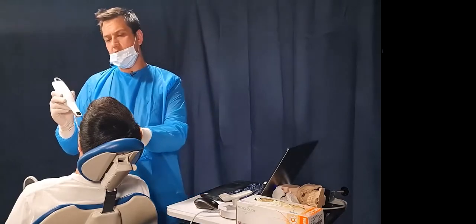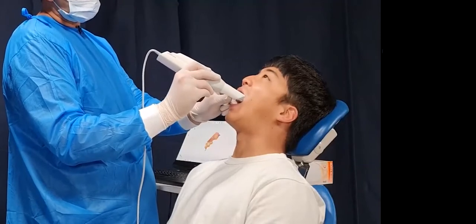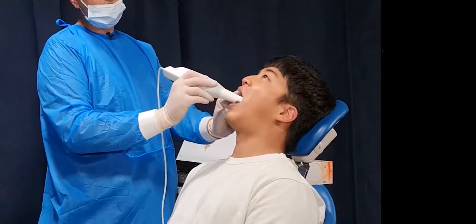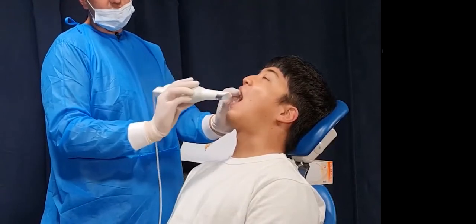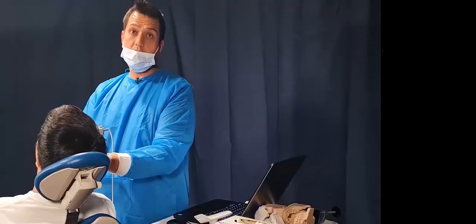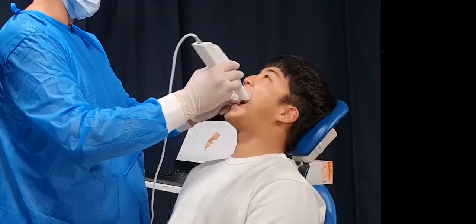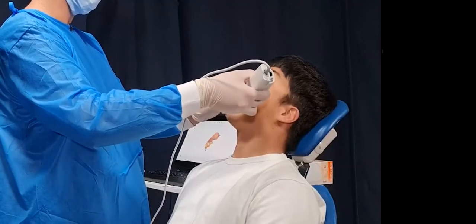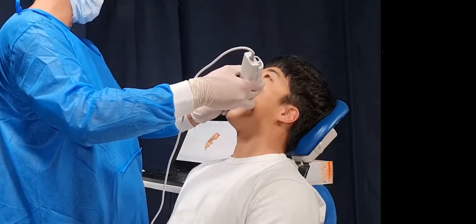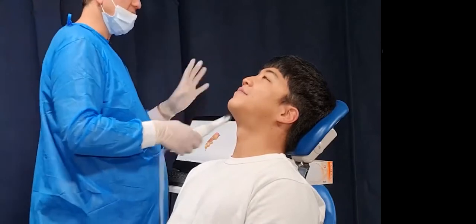So again, looking at the patient, when you've got the difficult undercuts, we're supporting our scanner, index finger down, thumb up, we're rolling. Sometimes you'll need to move, and my thumb is still supporting the scanner, and I roll to get into those undercuts. Very important to think about that. And again, the other side, index finger down, rolling perpendicular to the patient, getting that camera square inside the frame, inside the picture.